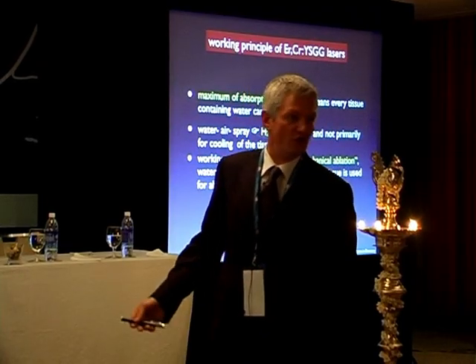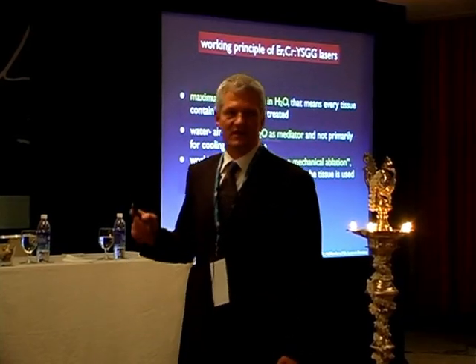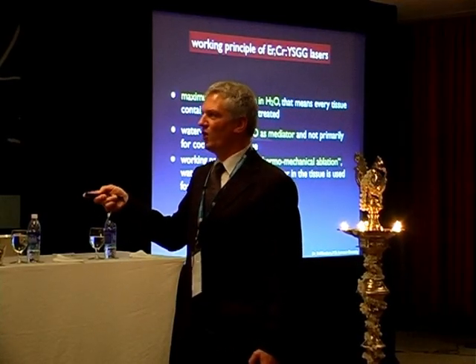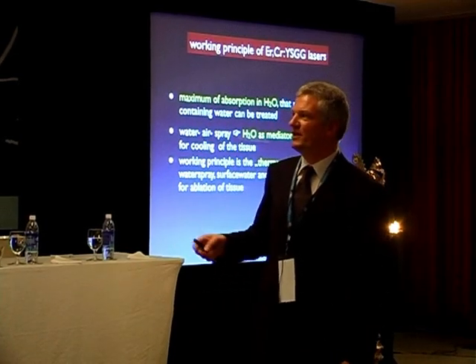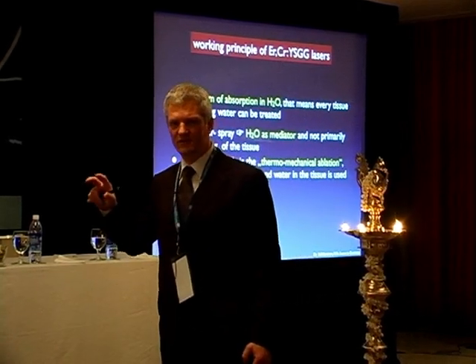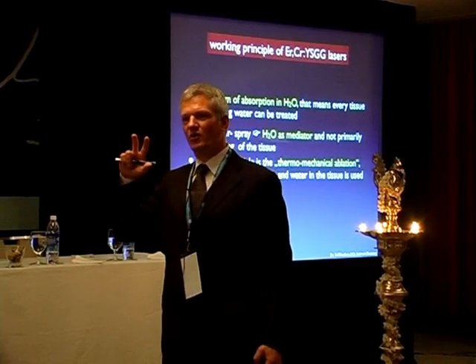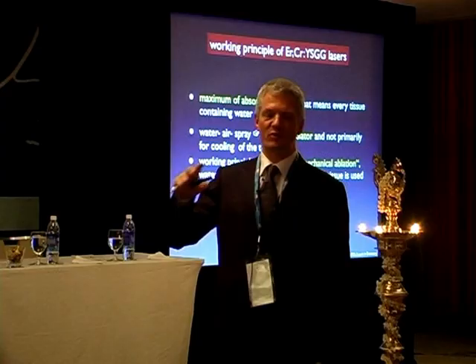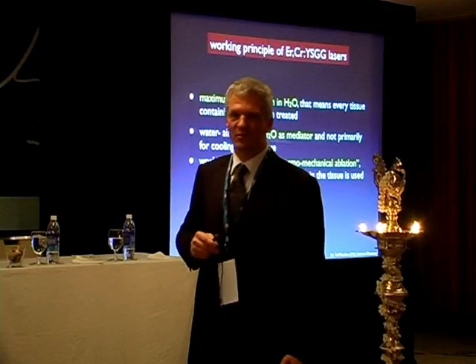The working principle of the erbium lasers is thermomechanical ablation. So that means it's very evident and necessary that you have water, because water is the mediator for the working principle. That means the erbium laser heats the water so that it explodes, and it does not only heat the water you are giving with the air-water spray, but it also heats the water in the tissue. So the tissue will explode from the inside and the water spray will explode from the outside. And so you can ablate the tissue.